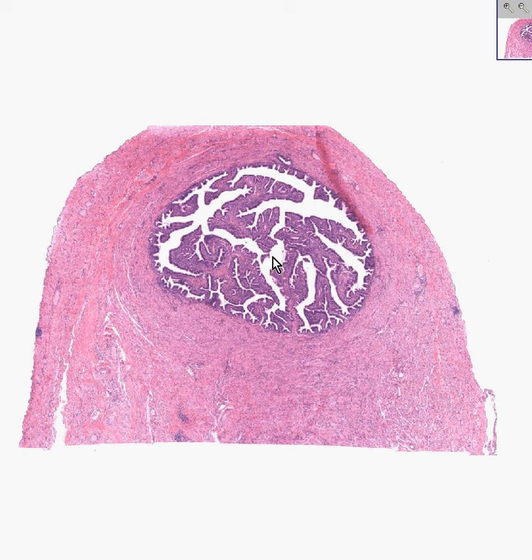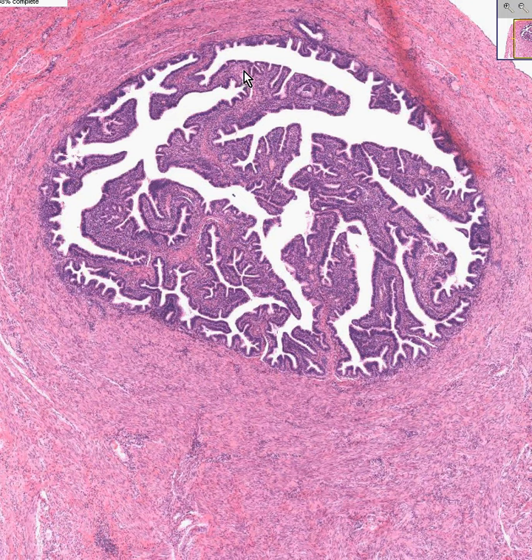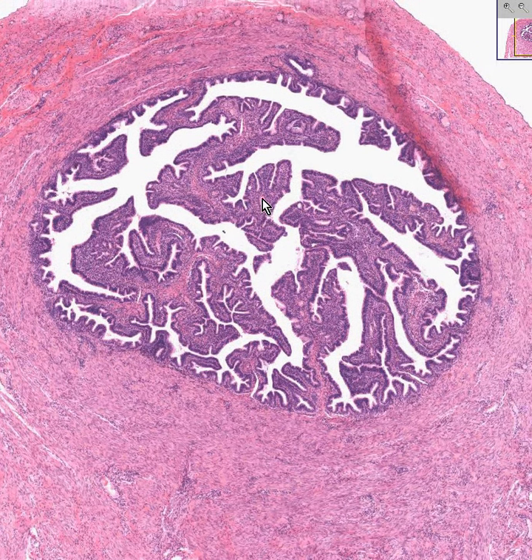Where it ends, near the surface of the ovary, it has these little papillary structures called fimbria. In another part of the tube, in which the lumen is still basically dilated, it has a mucosa which contains these papillary projections, which are really kind of the same thing that fimbria are composed of as well. When it gets closer to the uterus, it basically loses this papillary configuration and is just a round, flat mucosa.